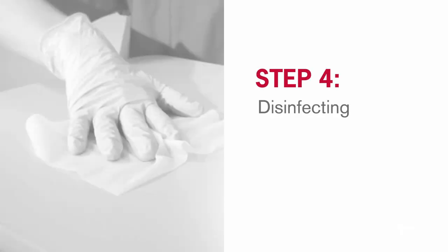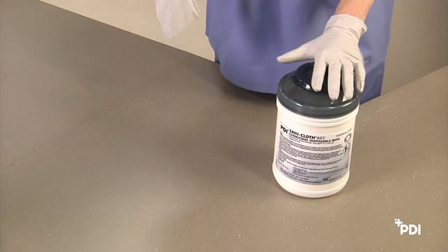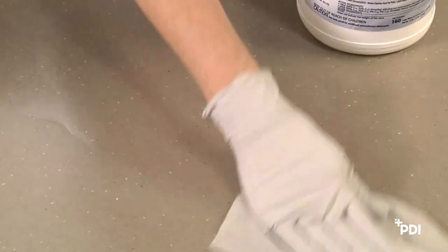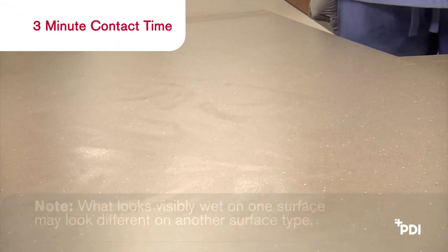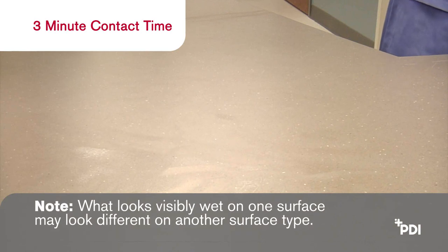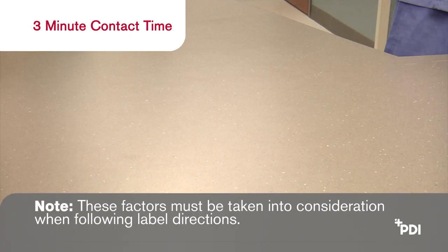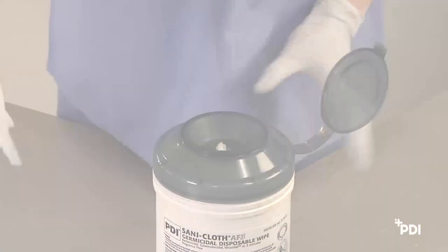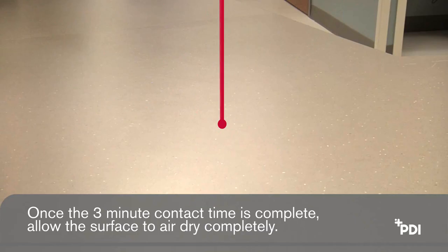Step 4: Disinfecting. To disinfect, there must be no visible soil on the surface. Dispense a wipe using the proper procedure in Step 2 and be sure to close the lid. Using the clean wipe, thoroughly wipe the surface, getting into crevices and corners. The highly absorbent material has improved fluid capacity and is both thick and strong. The treated surface must remain visibly wet for the full three minutes. Note: what looks wet on one surface may look different on another surface type. Evaporation rates are affected by room humidity, temperature, and air flow. These factors must be taken into consideration when following label directions. Use additional wipes if needed to assure continuous three-minute wet contact time. Once the three-minute contact time is complete, allow the surface to air dry completely.